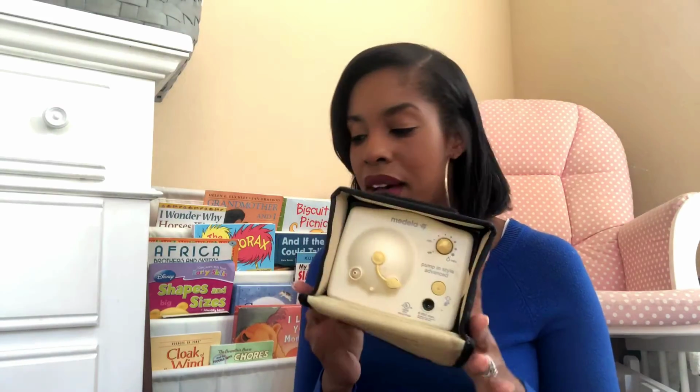So this is my pump, and I actually lost, or I think I left the plug somewhere, and thankfully there was another mom who had just finished breastfeeding and she had an extra plug. So this is actually my second plug. I believe that you can order these. If not, on the website, speak with your insurance once again and see if you can get this. I believe birthing centers, at least local birthing centers where I am, have supplies like an extra plug, extra, what are these called? Extra these.